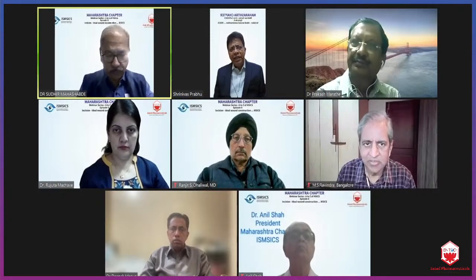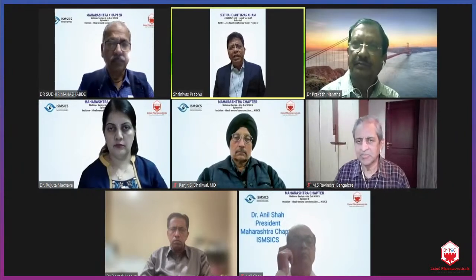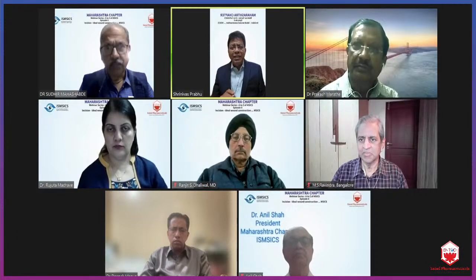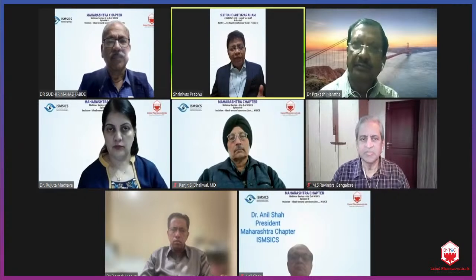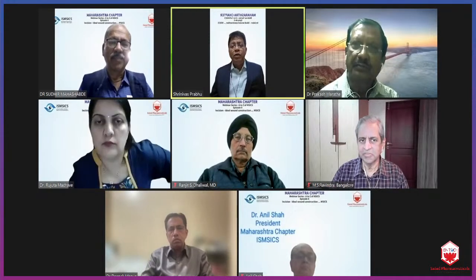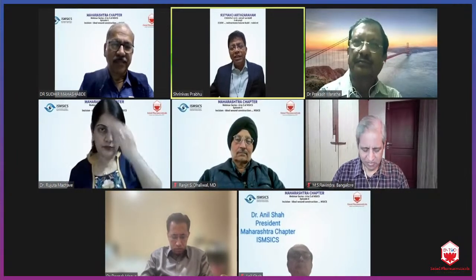And after listening to Dr. Thangaraj, I sometimes really feel that along with conjunctiva, taking the incision and then going into the cornea, because having done so many surgeries, I today still feel that if there is bleeding, even a small oozer is there while doing a SICS, I really start, nowadays people are literally comparing how much time it has taken. So this blood keeps on coming in between in remote places. Sometimes we don't have that kind of assistant to even give a wash. And one sister is giving something, sometimes only the trolley is there with us and we are doing.